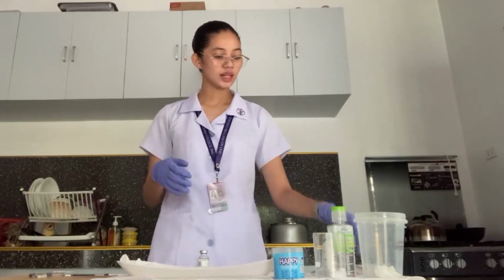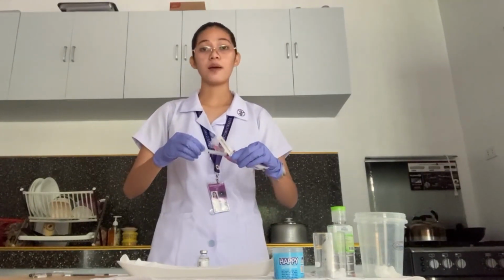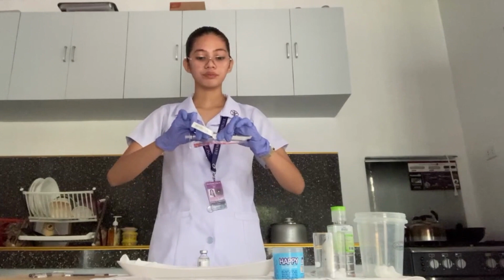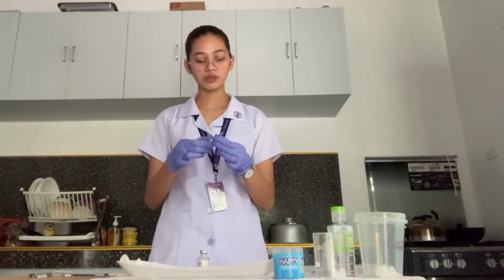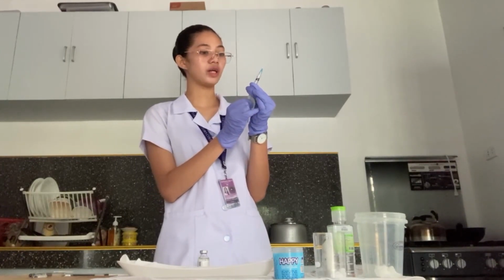Let us first grab our syringe, open the package. Then we're going to only touch the plunger and the barrel. Now, since this syringe already has a needle, this will serve as our aspirating needle in withdrawing the medication. Now, let us uncap the syringe, and then we're going to withdraw some air, making sure that it's equal to the medication needed or requested by the doctor. Now, since the doctor requested 2 milliliters, we're going to withdraw it here in the syringe.